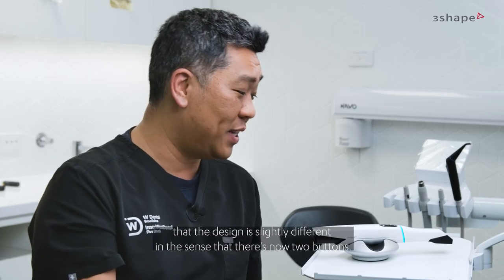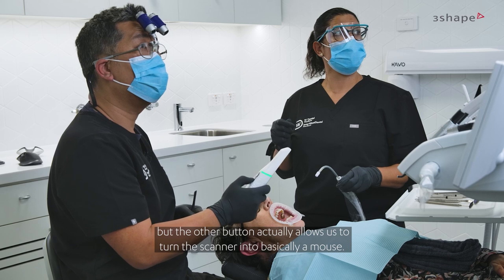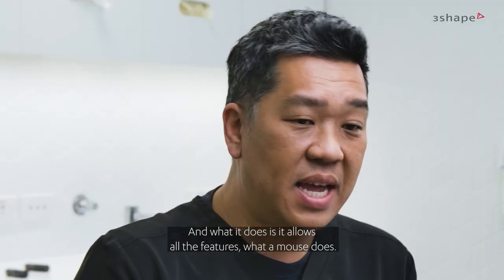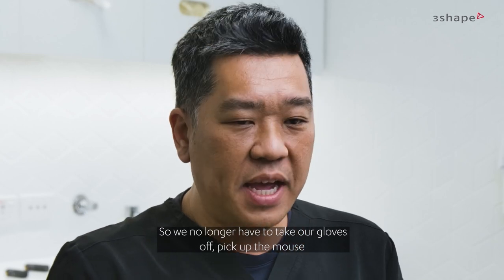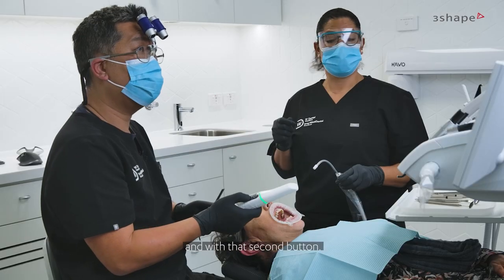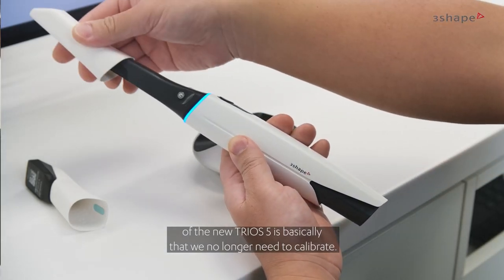With the Trios 5, you'll see that the design is slightly different in the sense that there are now two buttons. One button is obviously to turn the scan on and off, but the other button actually allows us to turn the scanner into basically a mouse. It allows all the features of a mouse, so we no longer have to take our gloves off, pick up the mouse, and go and trim the models — all of this can be done by just holding the scanner and using that second button.